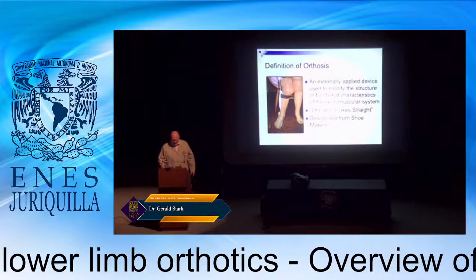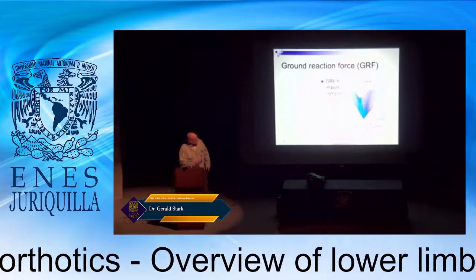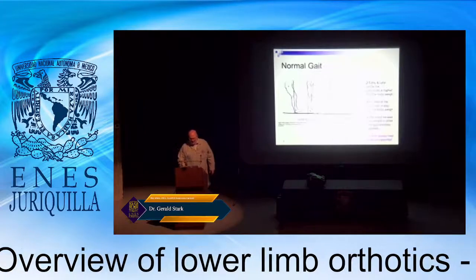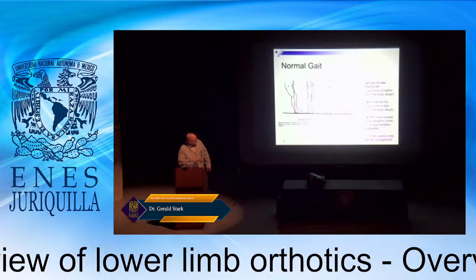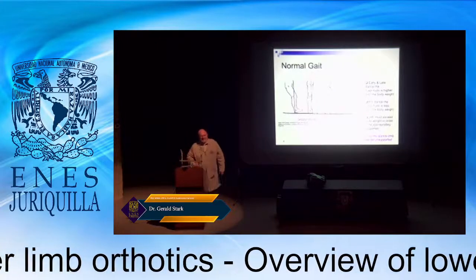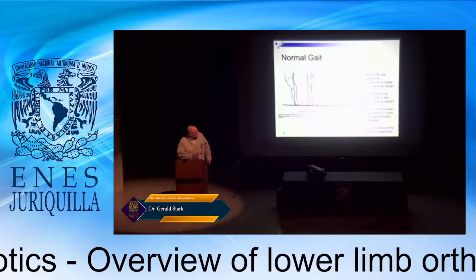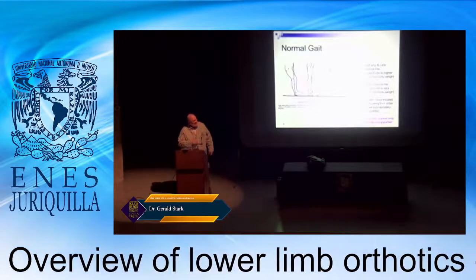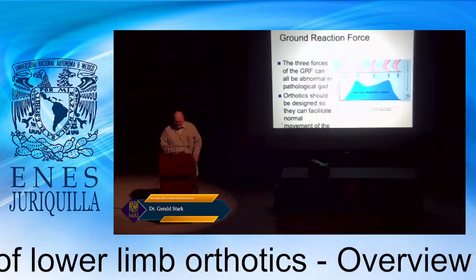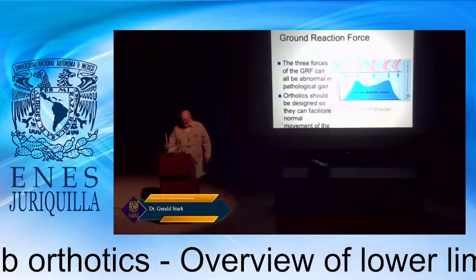But our main goal is to manipulate this ground reaction force. So what we want is a strong ground reaction force and to maintain that stability while the patient walks. We want to make sure we have good stability in early stance, but then also allow movement late in stance. And this is sometimes the issue for us. We overstabilize things at heel strike, but make it very difficult or impossible to move the leg late in stance. So it's this ground reaction force that we need to be aware of and how we manipulate it.